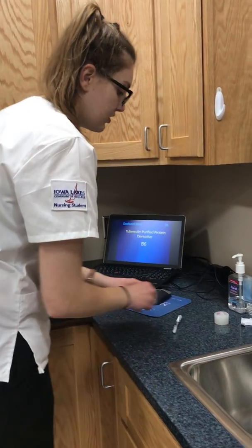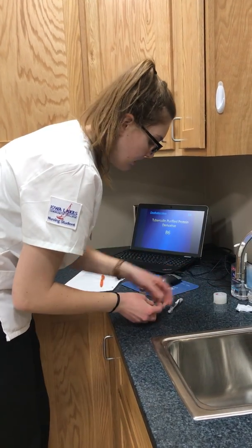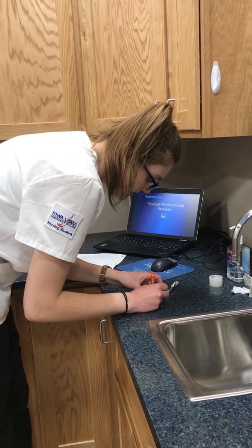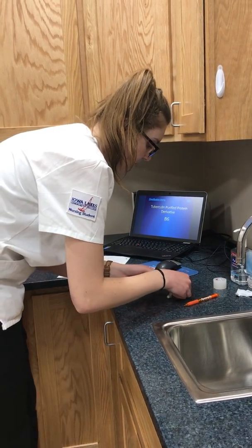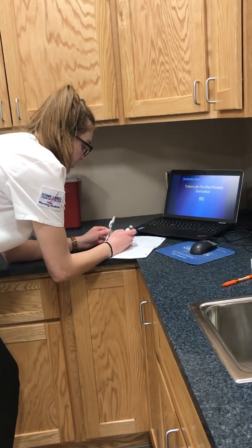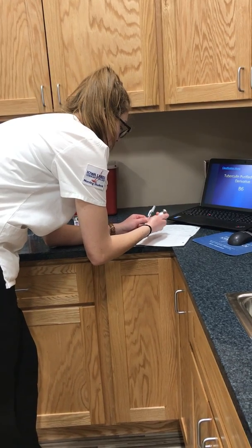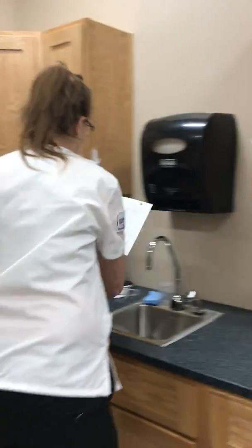I'm then going to grab a piece of tape and I will label this syringe with the patient's name, medication, dosage, and all that information so I'm able to clearly know what's in it. Once I've done that, I will double check my medication against my medical record. It looks like it is the correct thing, correct dosage. So I'm able to grab all this stuff and go into the patient's room.